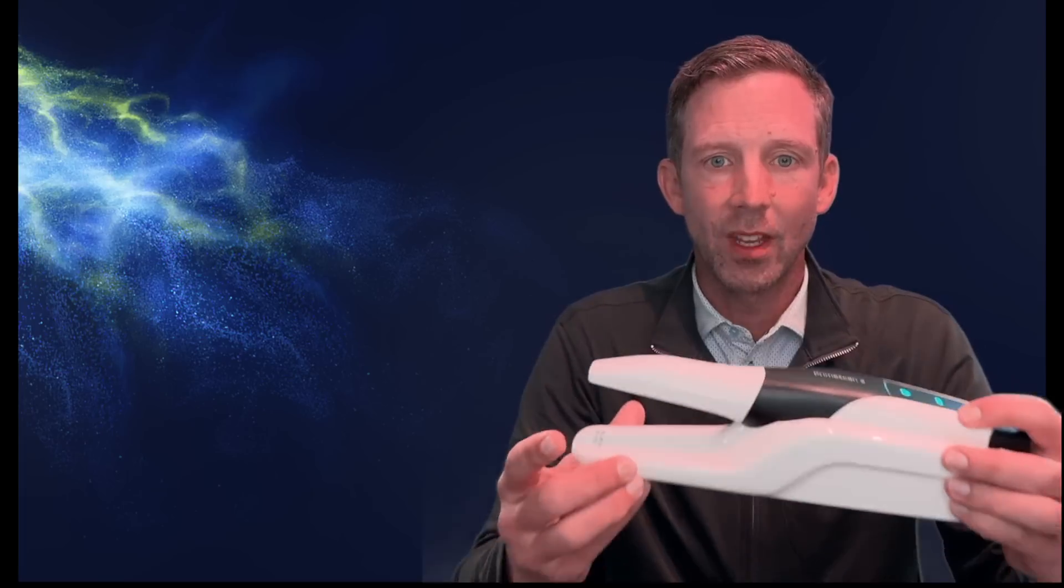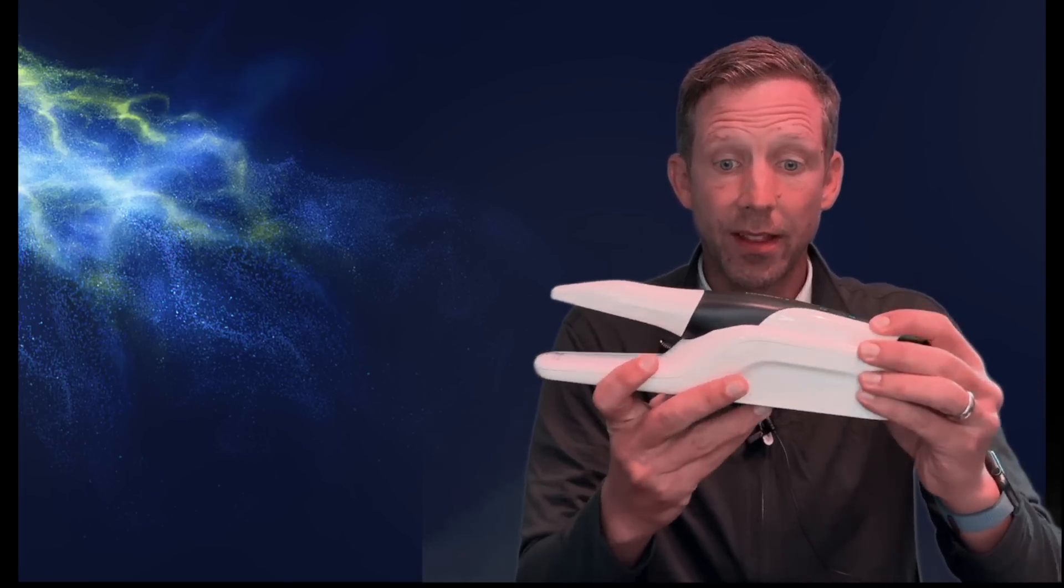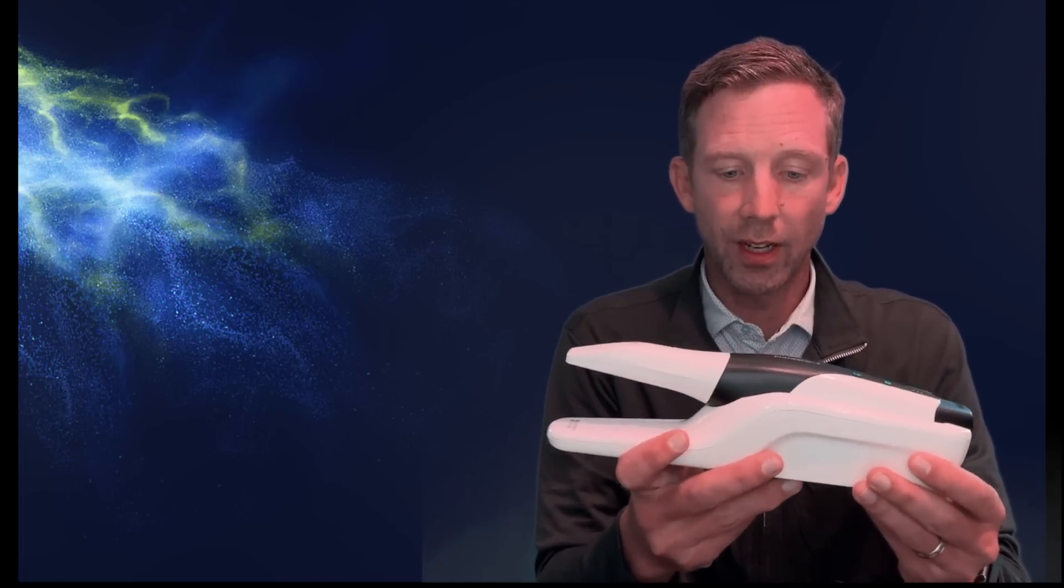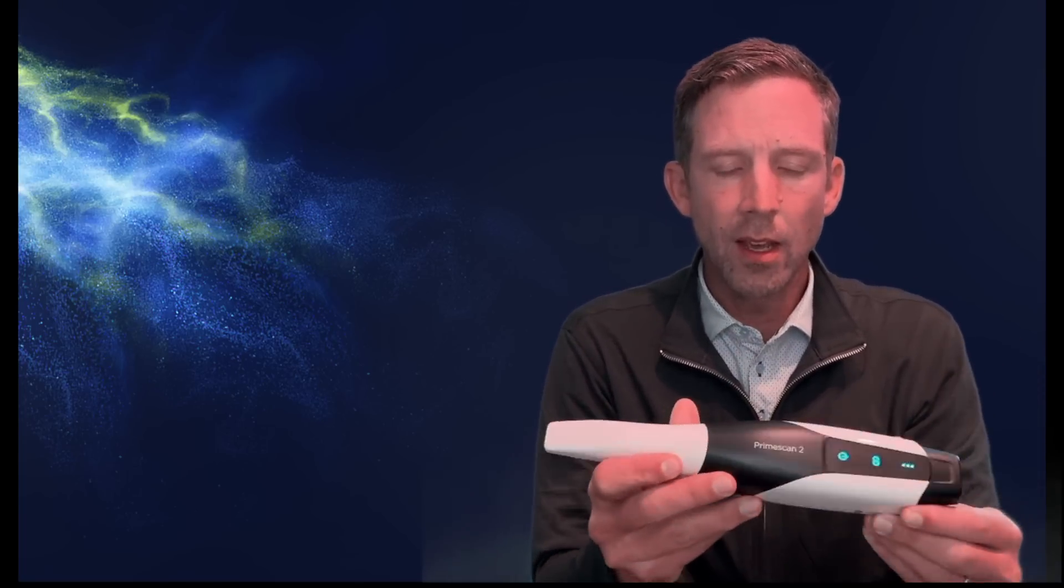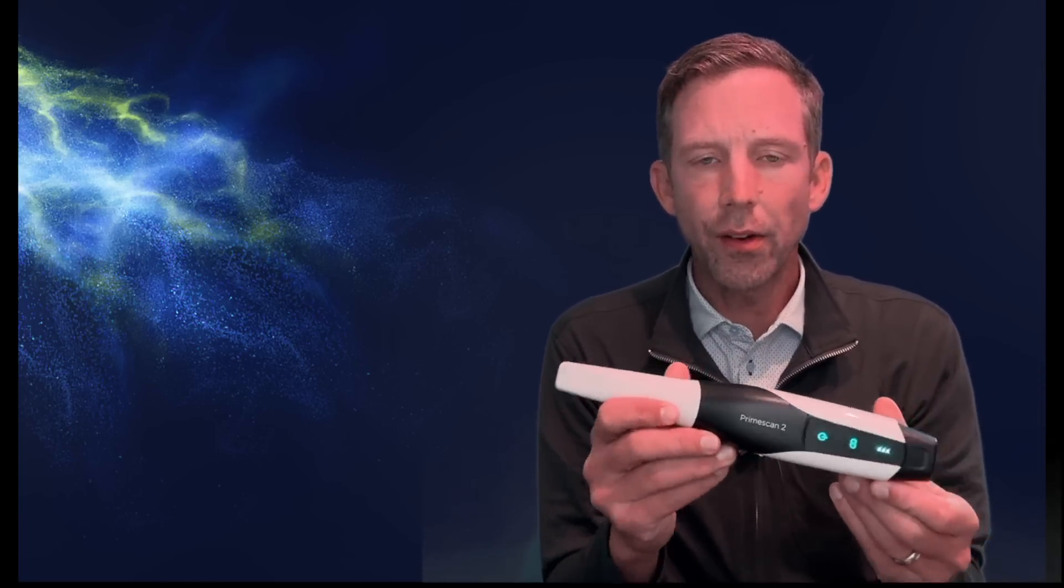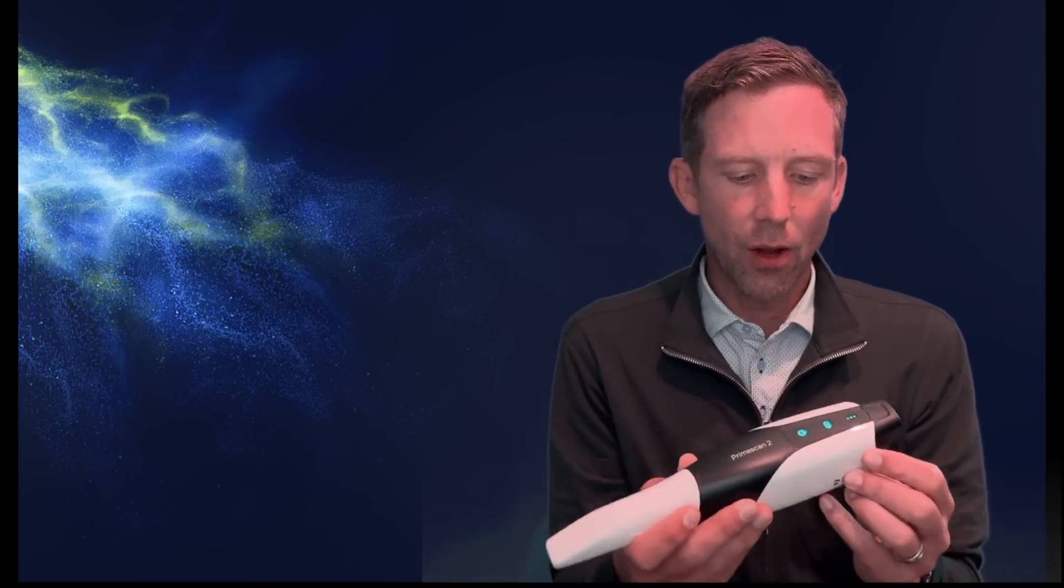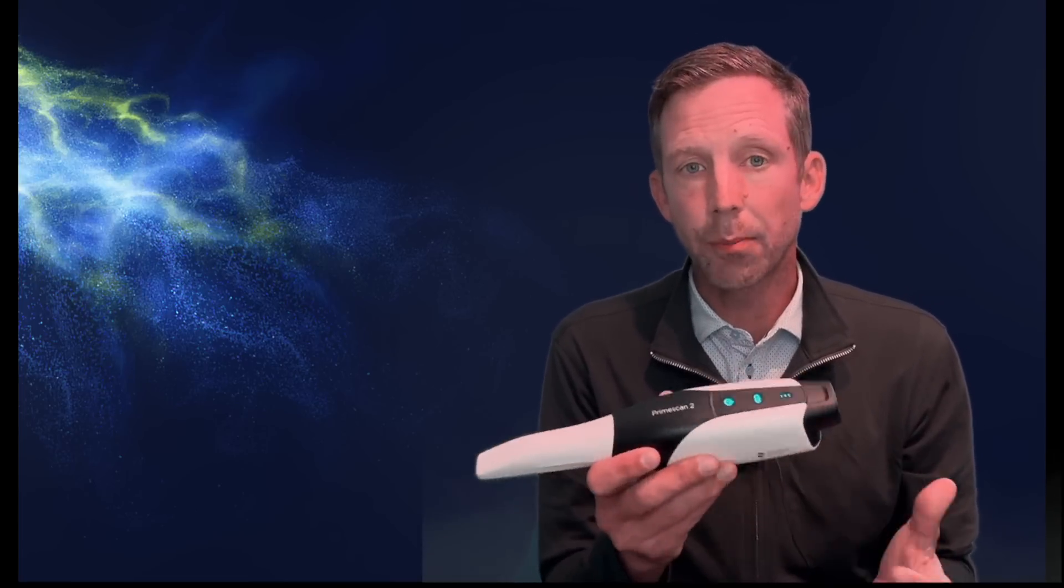So if we look at the PrimeScan 2 here, you can see that it comes on this nice little platform so you can store it in your operatories. And obviously, as you can see, it is completely wireless.